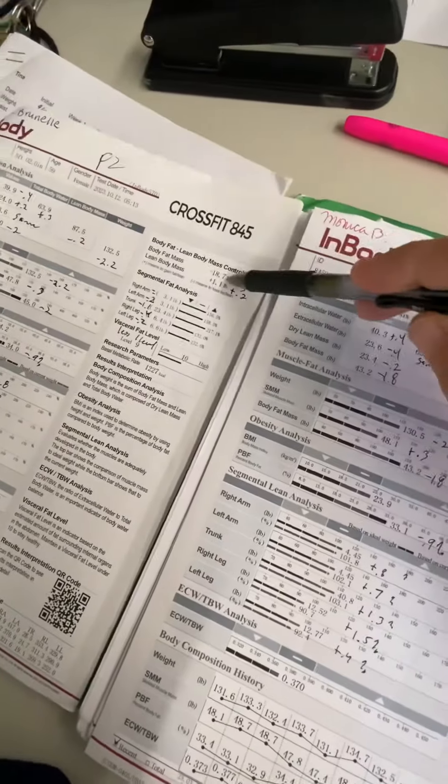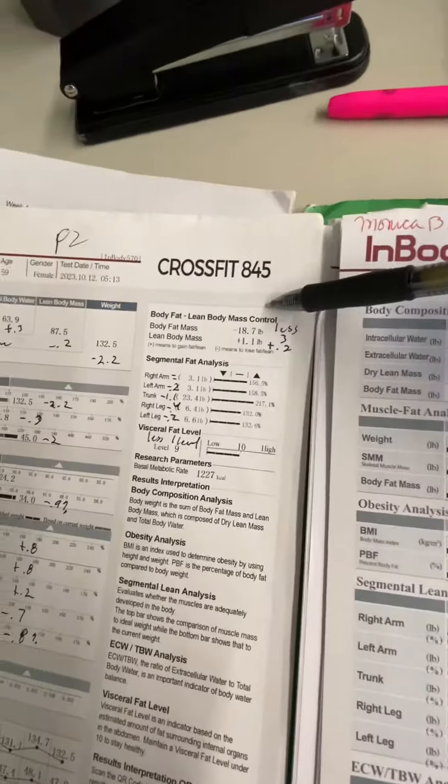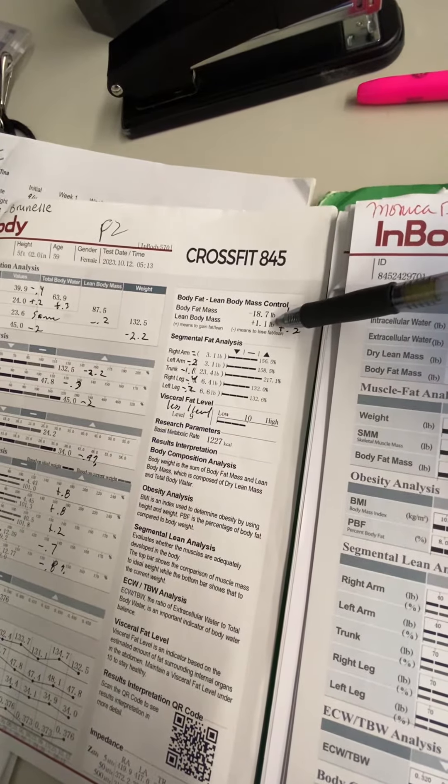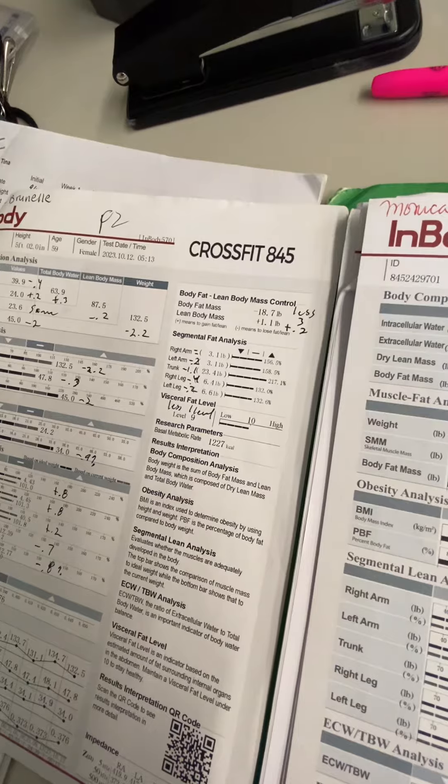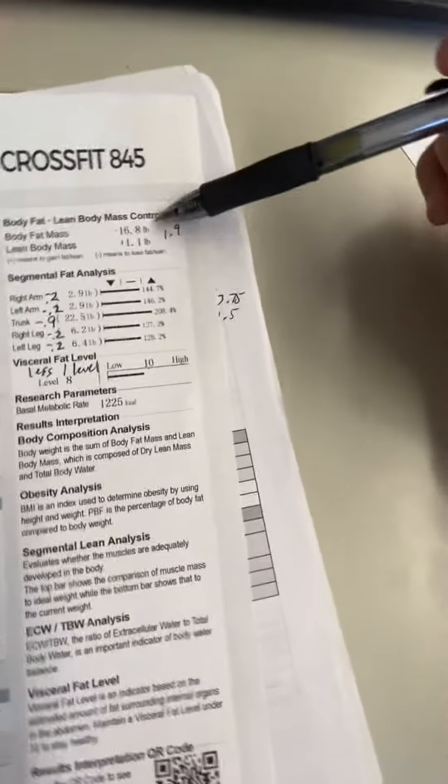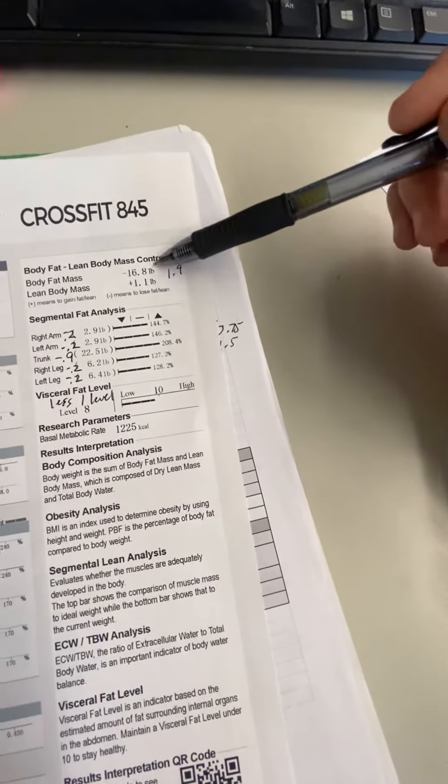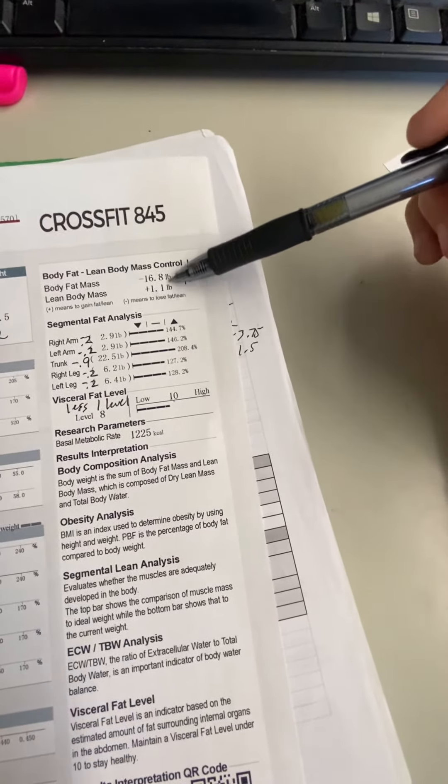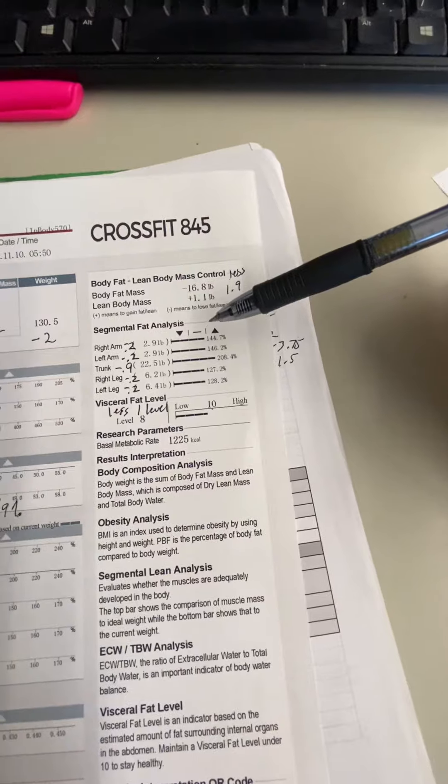So your previous scan was recommending 18.7 pounds of body fat loss and gaining 1.1 pounds of muscle. This one's less 1.9, so it's recommending 16.8 pounds of body fat loss, but that muscle thing is still there. We still need to gain muscle, but all in all, really happy with this scan for you.